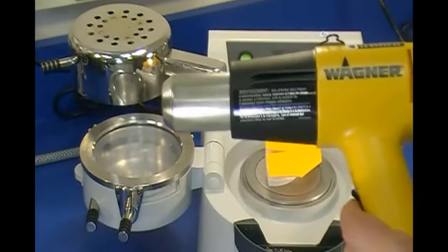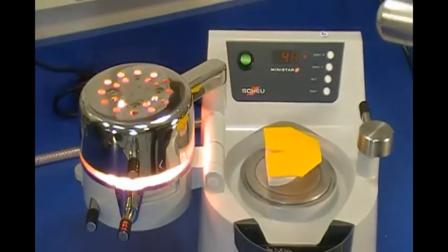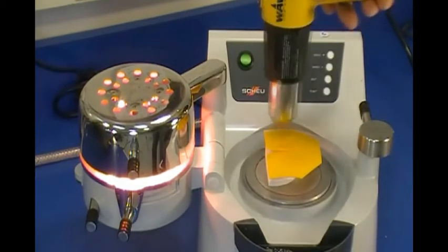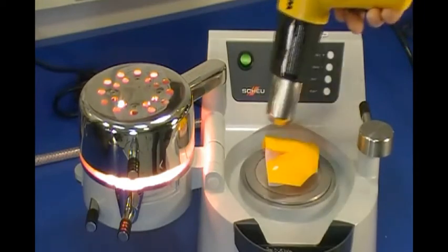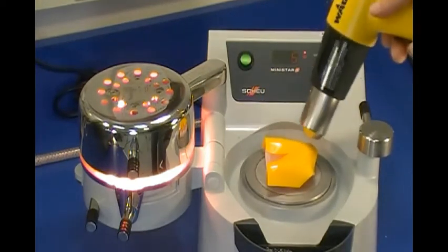Turn the heat gun on high and swing the lamp over the clamped material to start the heating cycle. With about 50 seconds remaining in the heating cycle, soften the template laying on the model with the heat gun. As the heating cycle nears its conclusion, material over the model should drape around the model.